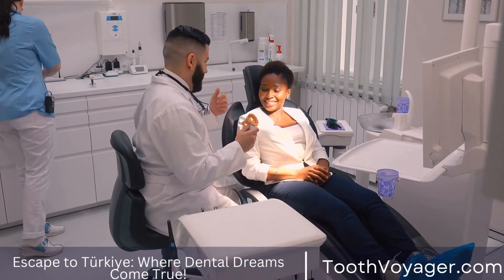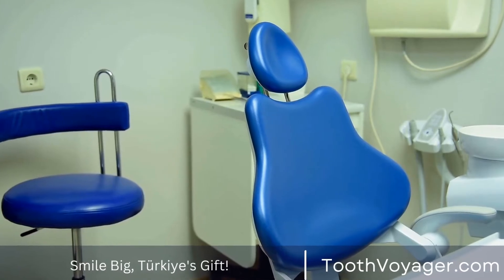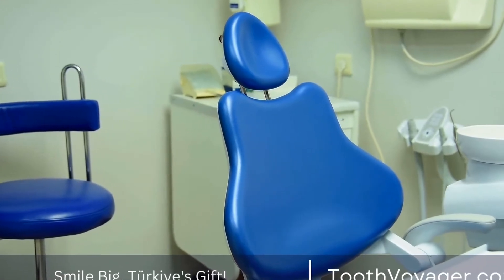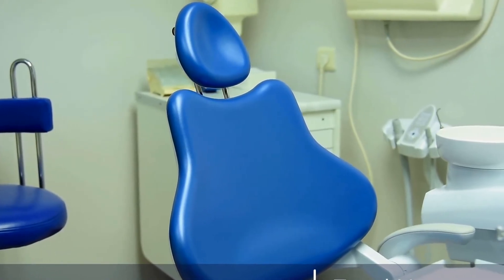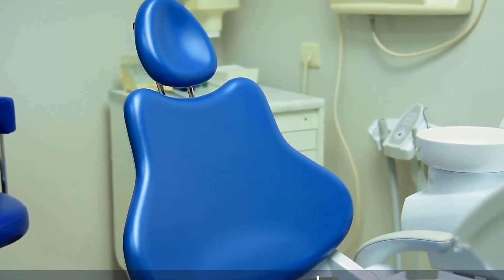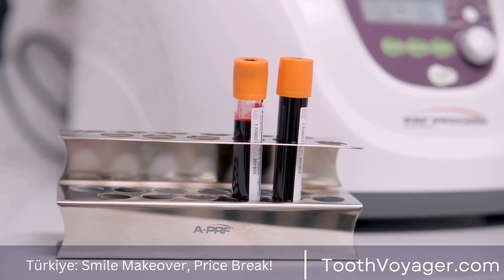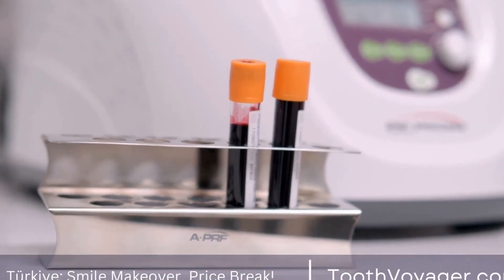Mini dental implants are smaller in diameter than traditional implants, making them a less invasive option for patients who may not have enough bone density to support larger implants. Mini dental implants are often used to stabilize dentures or bridges, providing additional support and retention.